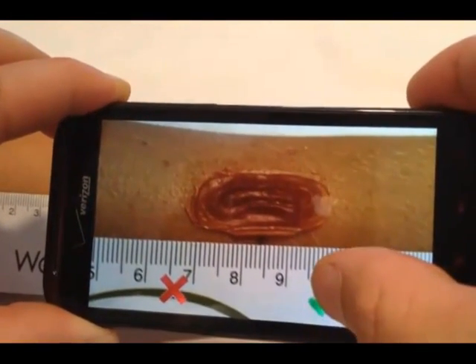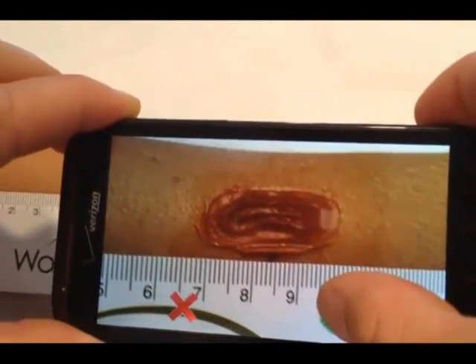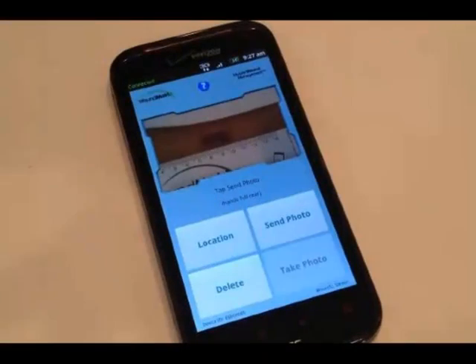Tap the green check mark to accept the picture. You now return to the main screen.